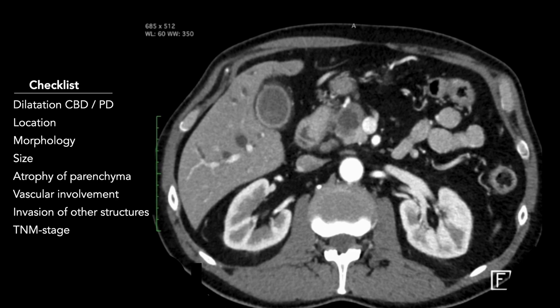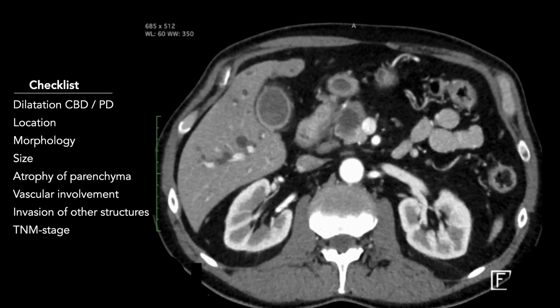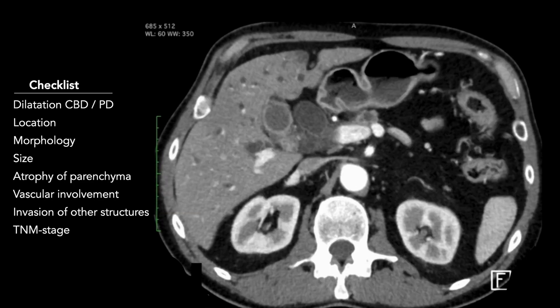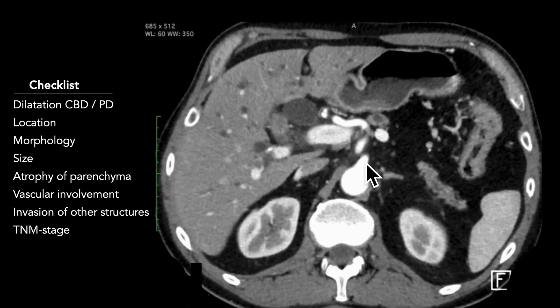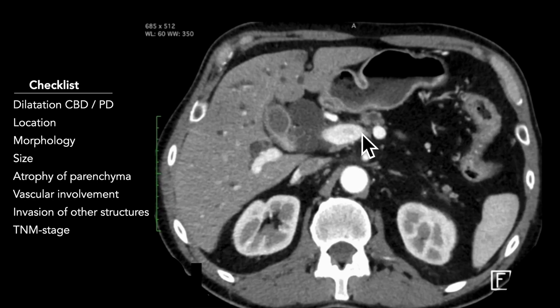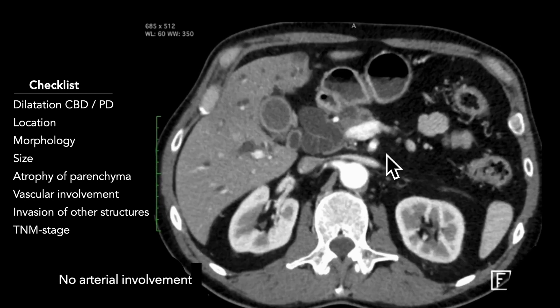The next step is measuring the size of the lesion — 27 millimeters in this case. We then assess vascular involvement, starting with the celiac trunk: no involvement. Common hepatic artery: no involvement. SMA: no involvement.